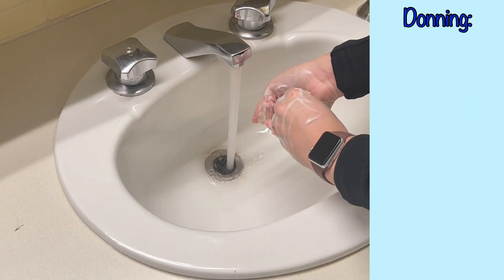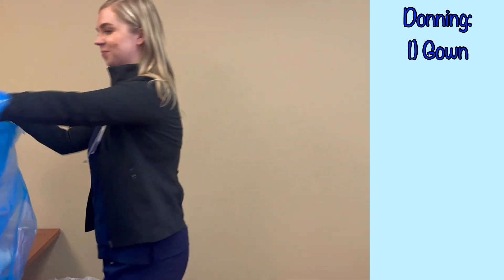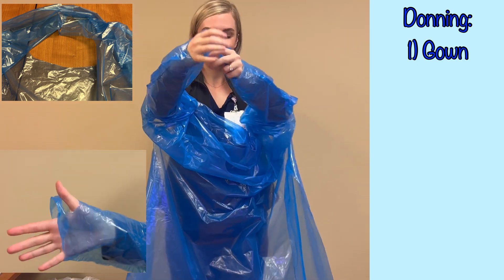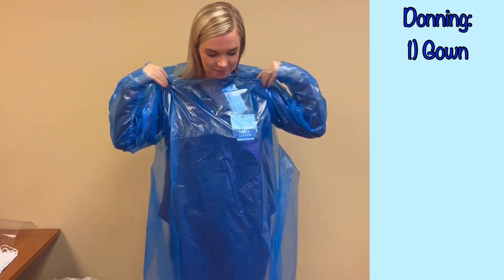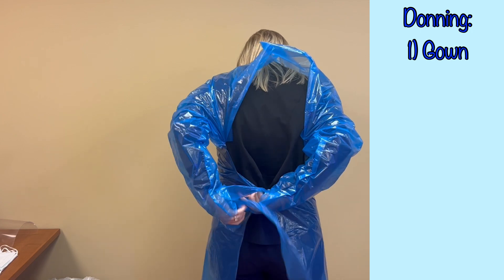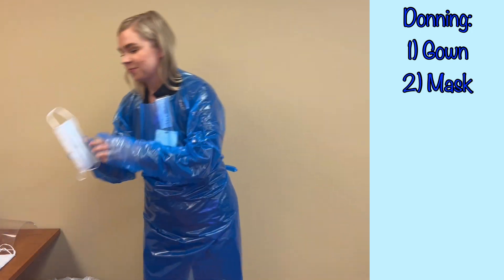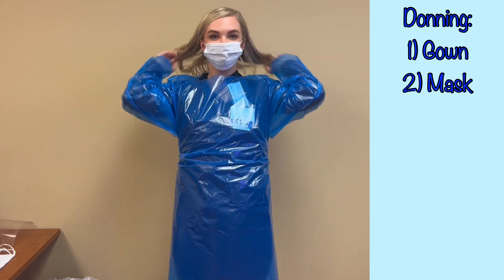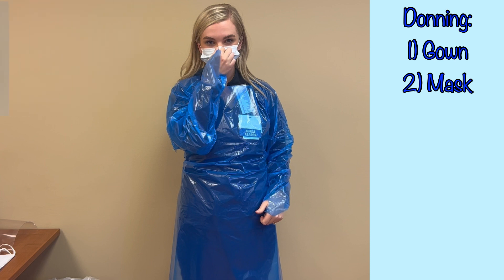To properly don these PPE items, first wash your hands, and then begin with the gown. This disposable gown has a hole for the head as well as thumb openings at the hands. Some gowns will require a tie behind the head and may have elastic at the wrists instead of thumb holes. The gown should fully cover the torso from neck to knees, and arms to at least the end of the wrists. Tie the gown behind your waist. Next, don the mask — it should extend from the bridge of your nose to below your chin. With surgical masks, be sure to pinch the mask at the bridge of your nose to properly form it to your face. If you are wearing a respirator for airborne precautions, you should have been fit tested to ensure proper fit and function.